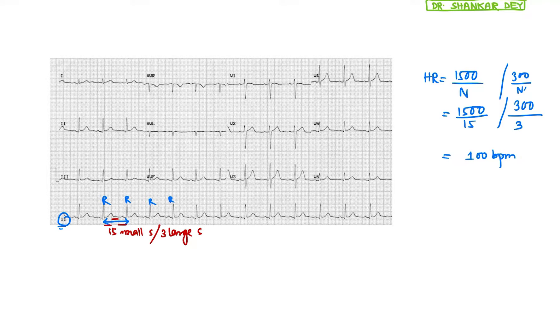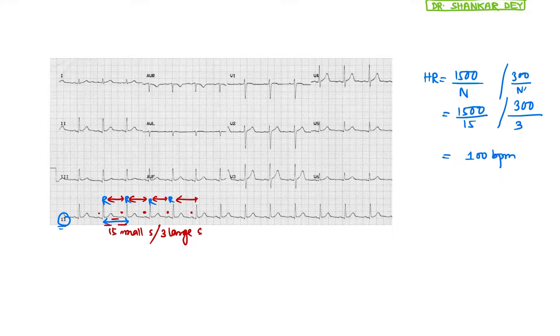The heart is beating at the rate of 100 beats per minute. If you see carefully, the distance between two R waves is always the same. The distance between two P waves is also the same, and the configuration of the QRS complex and T wave is within normal limits. So this is actually sinus rhythm. The heart rate is within normal limit and all configurations and PR intervals are regular — this is sinus rhythm.